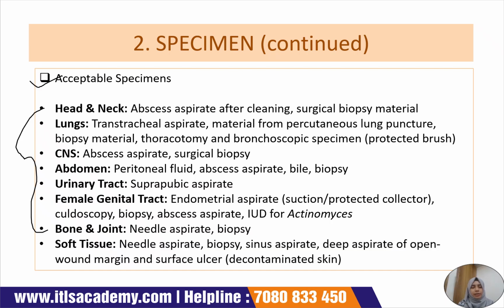Okay, from the lungs, transtracheal aspirate is taken, materials from percutaneous lung puncture are taken, biopsy materials are considered, thoracotomy and bronchoscopic specimens are considered, and bronchoscopic specimens must be taken from a protected brush.